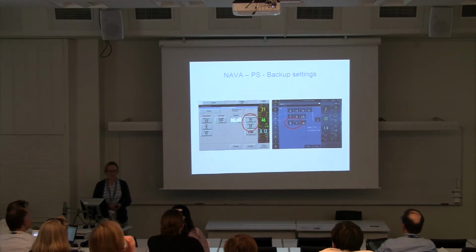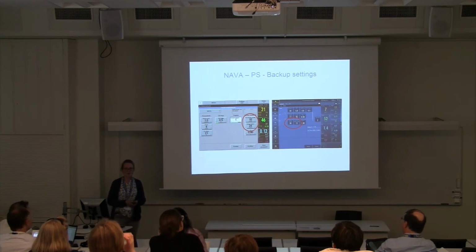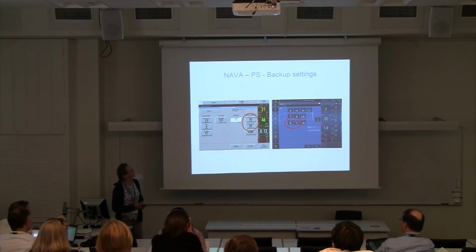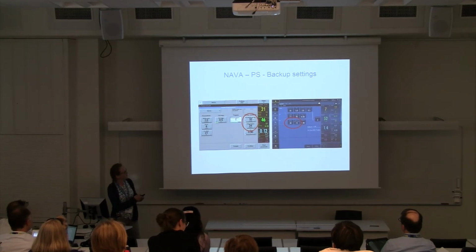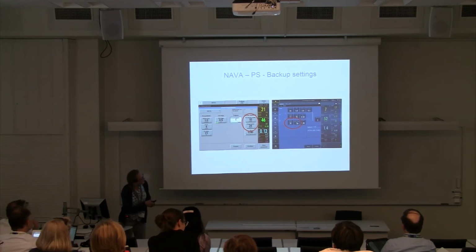But then there are some special cases where NAVA does not work, and the most common is apnea, when the EDI signal is flat. And in case of apnea, we have to have these backup settings. For these babies, we chose to have the frequency of 24 and the pressure 10 over 4. And for the other, 30 and 15 over 5.